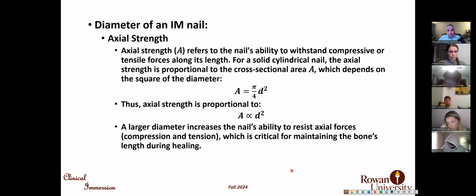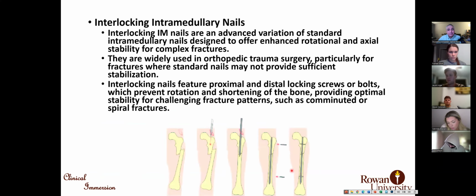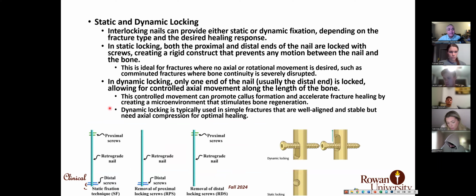But we have another option. The other option is not using the screws on one side at all, only using them on one side. This is less stable, but this is another option for having dynamic locking.